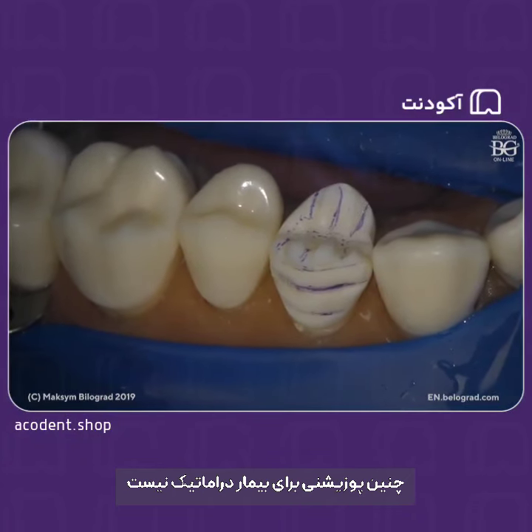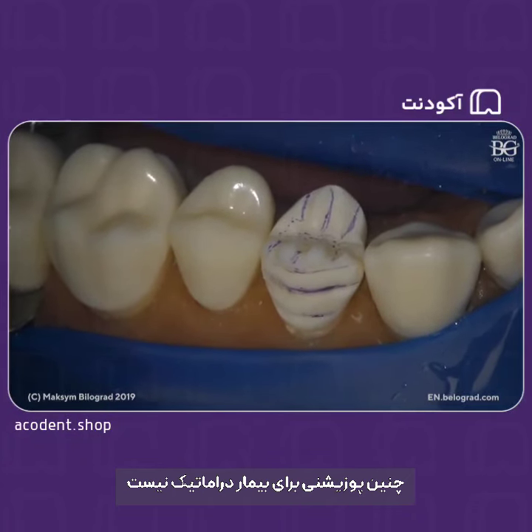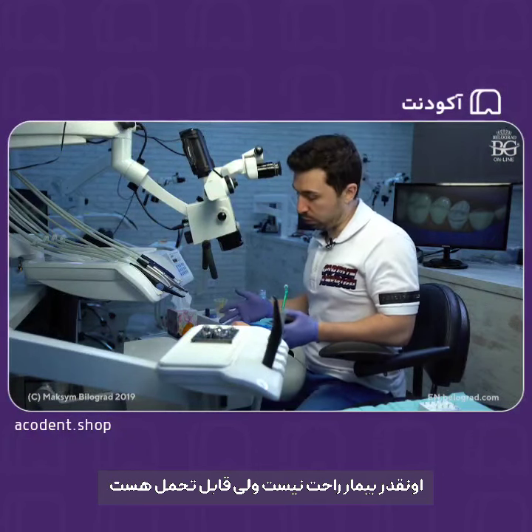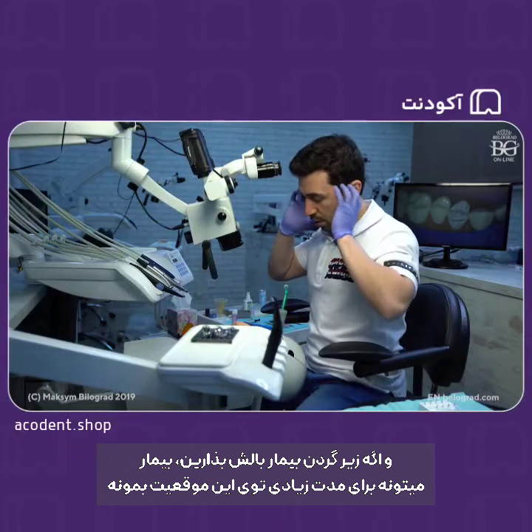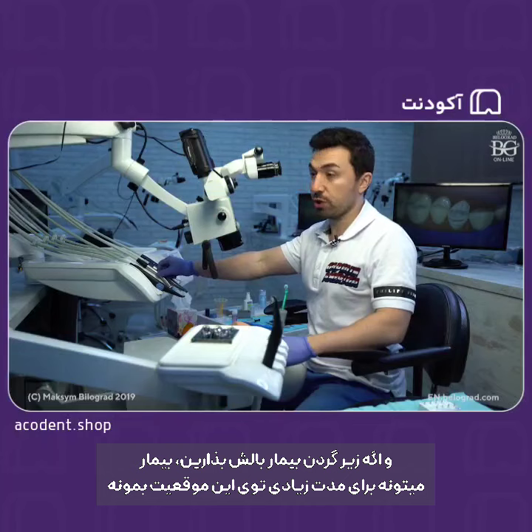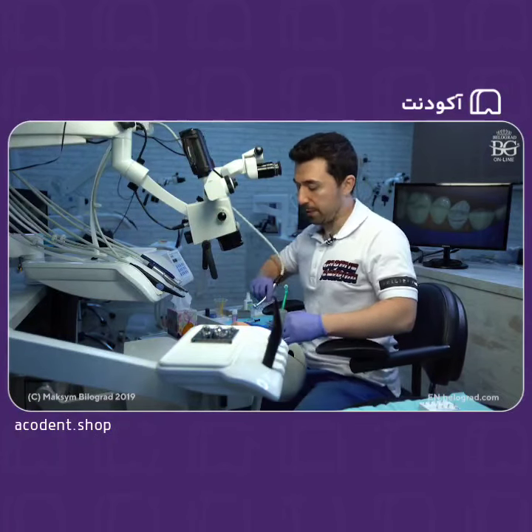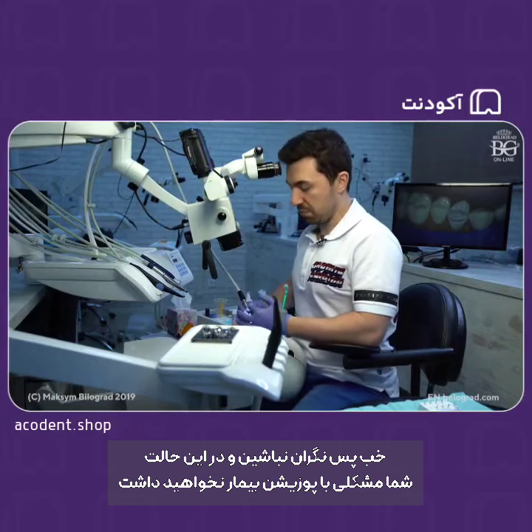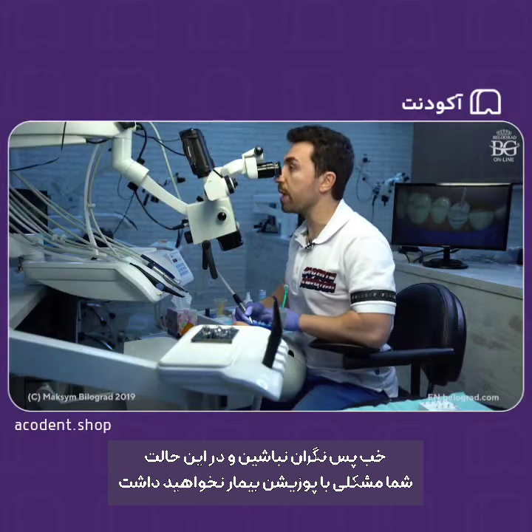This position for the patient is not dramatic. It is not super comfortable, but it is tolerable. If you put a pillow underneath the neck, your patient may stay in this position for a pretty long time. So don't worry, you will have no problems with your patient's position.